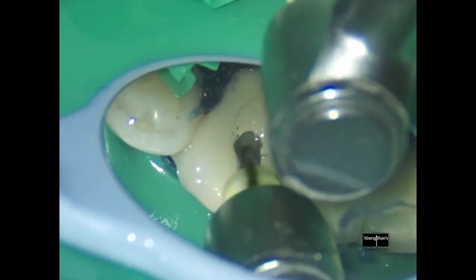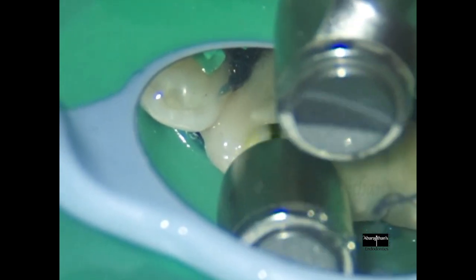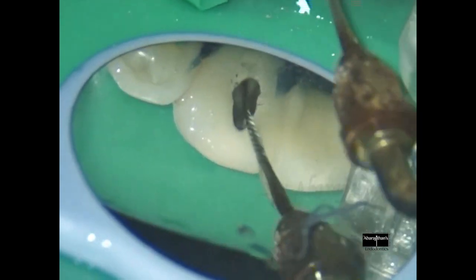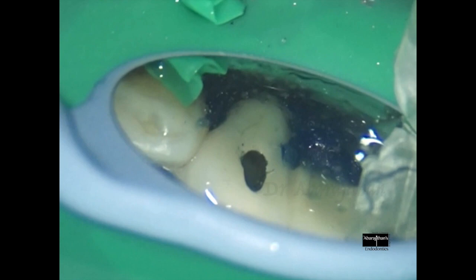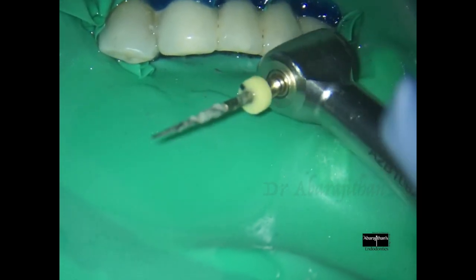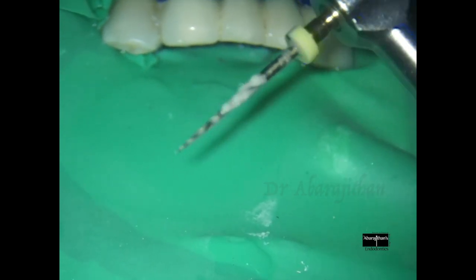Now I am using my orifice shaper to open up the coronal and middle third of the root canal. The volume of the pus that was being discharged through the canal is getting reduced slowly as we go through the instrumentation process. For debriding the coronal and middle third of the canal I use continuous ultrasonic irrigation with U-files, which we already discussed in one of the tales earlier. You can see the amount of debris that has been accumulated in the flutes of my orifice shaper where its action is maximum.